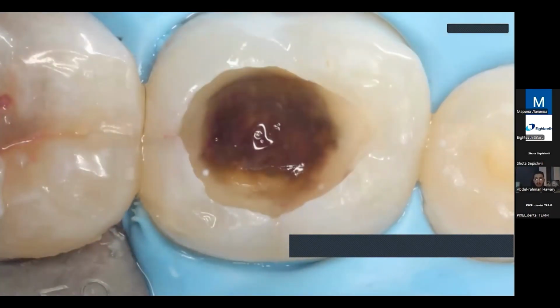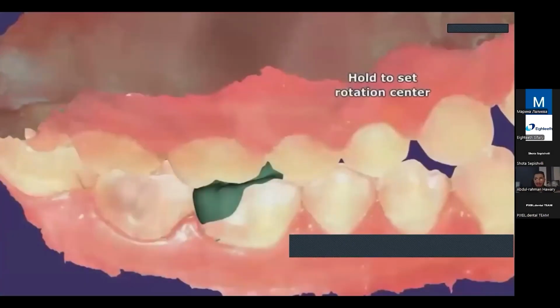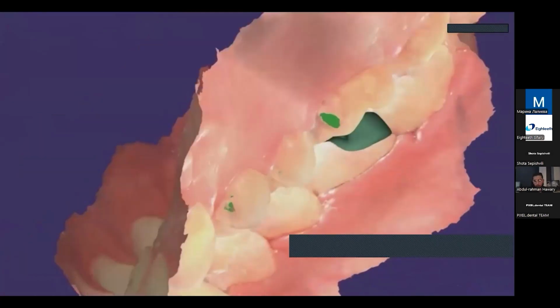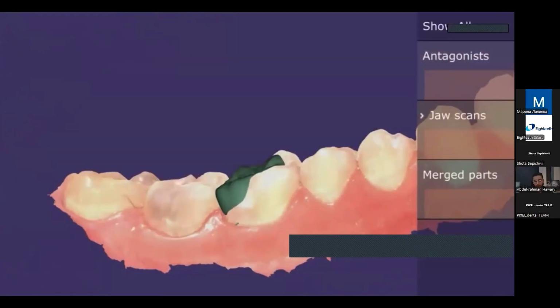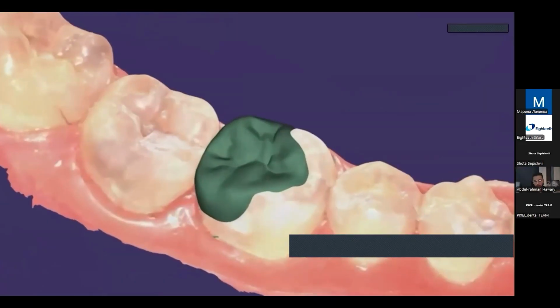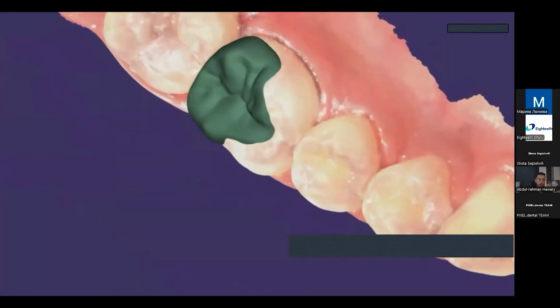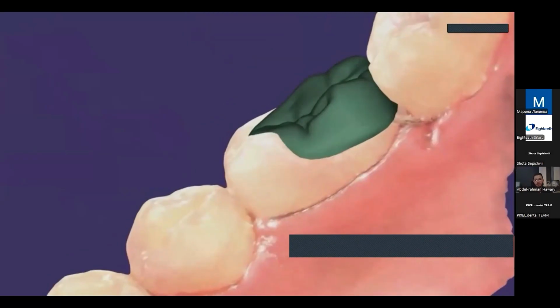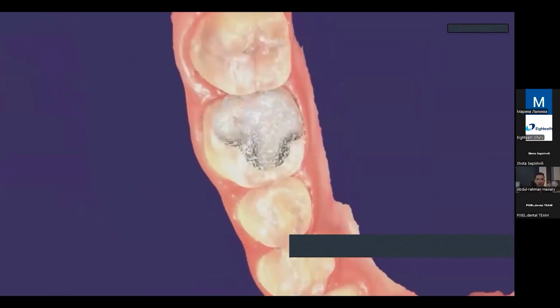Here we have done the IDS and the RC, and this onlay preparation was scanned using our Helios 700 intraoral scanner, and this is a video showing the scan and the design over the designing software. This is to show the scan itself without the designed restoration based upon it.